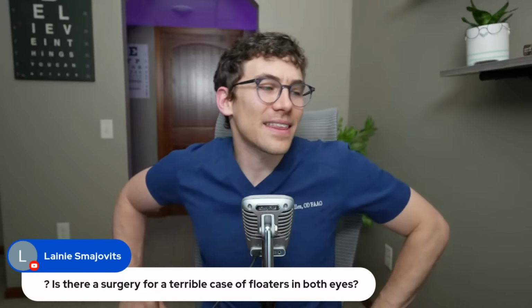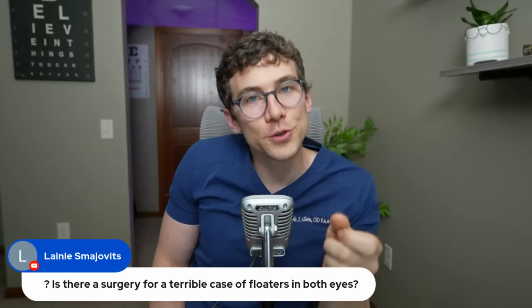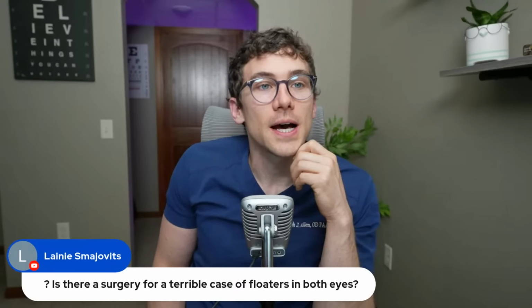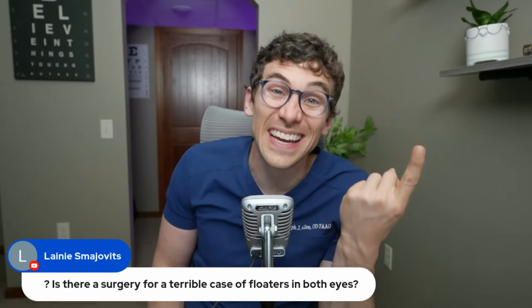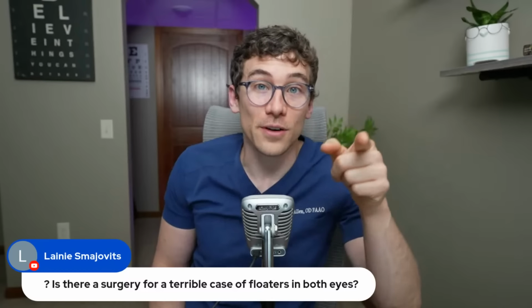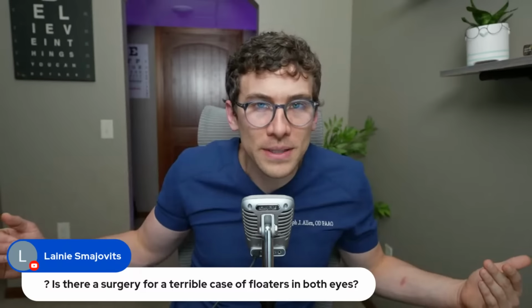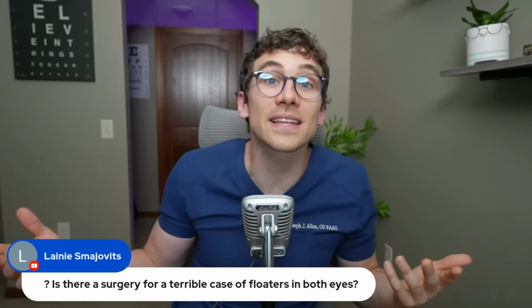For Lainey, thank you for asking about terrible cases of floaters in the eyes. So I have done some other videos on surgical options for floaters, and this is something definitely to consider if somebody's struggling with large floaters. The two most common surgical options available are either using laser vitreolysis, which is where your doctor can use that same YAG laser we discussed before for the posterior capsular opacification, except it's used deeper inside the eye to break up large floaters. It doesn't get rid of them completely, but it breaks them up into smaller pieces, and it vaporizes some so that people are less symptomatic.